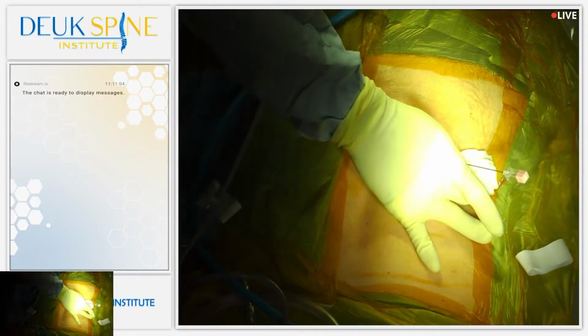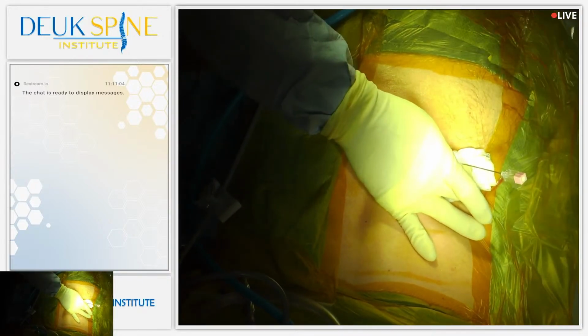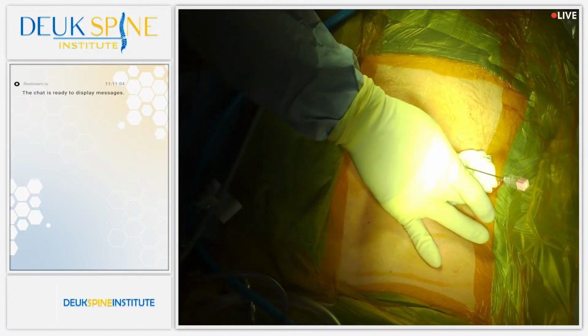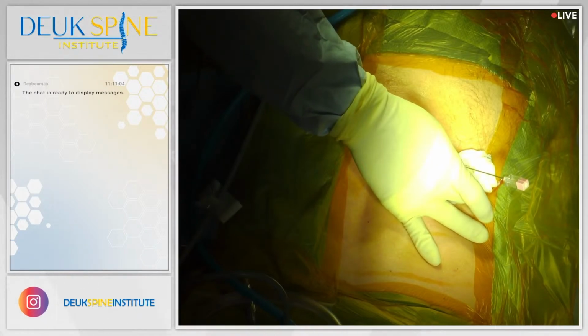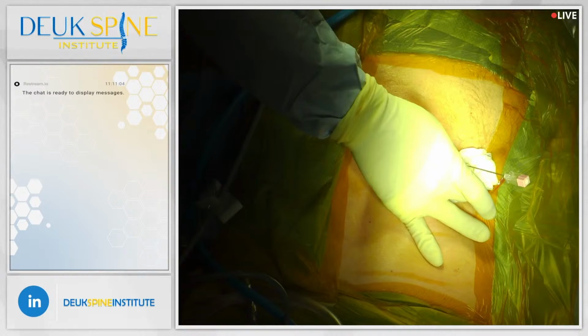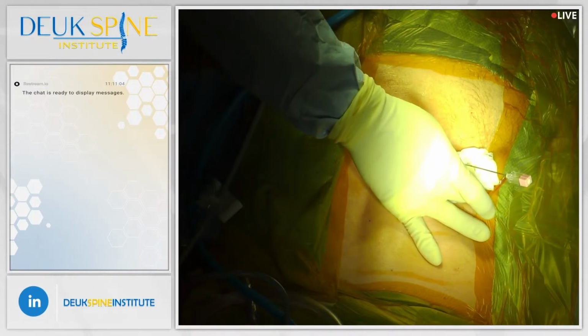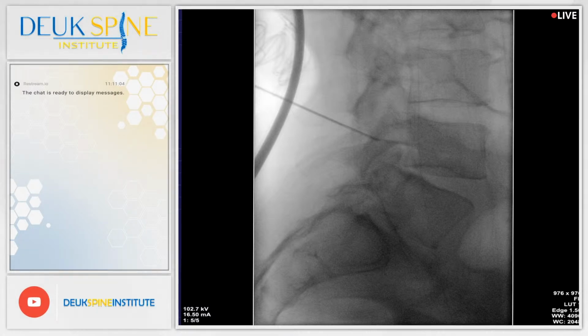Welcome back. Our patient is from Canada, and you've just watched our video on how herniated discs actually cause so much back pain. We're trying to get our x-ray machine lined up perfectly with the spine. I think that's looking a little better there, Jordan.